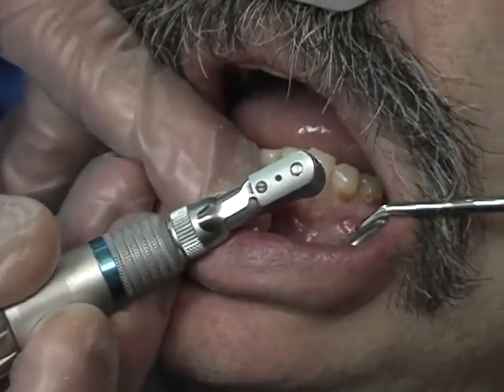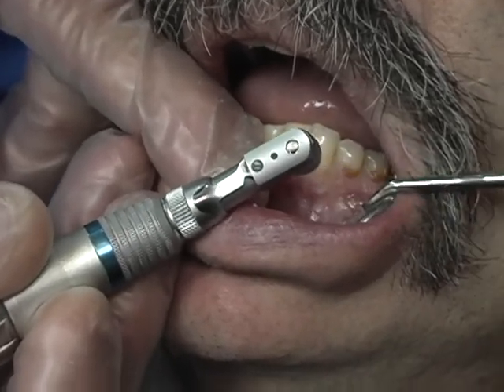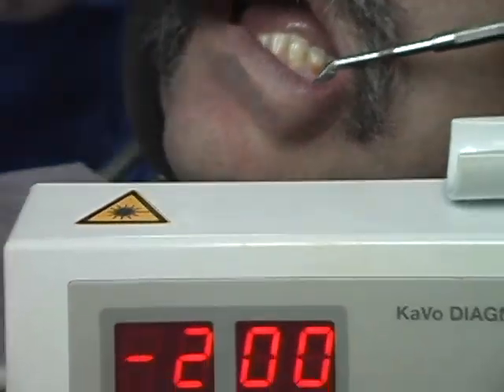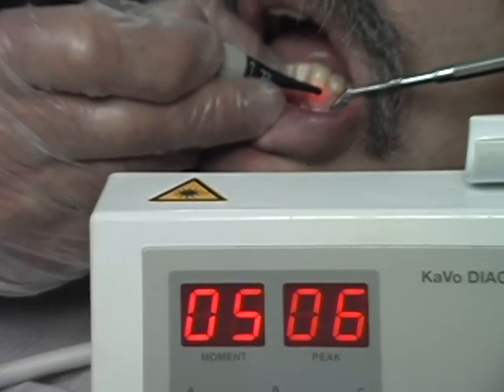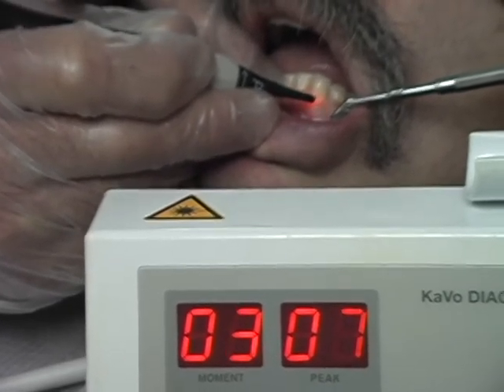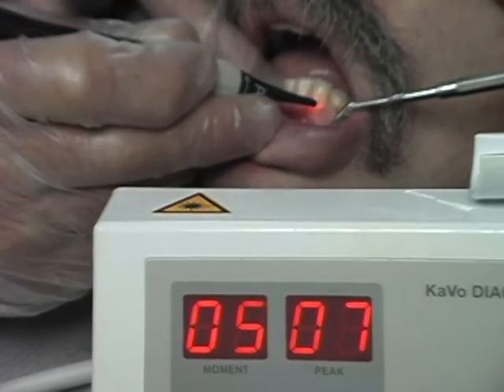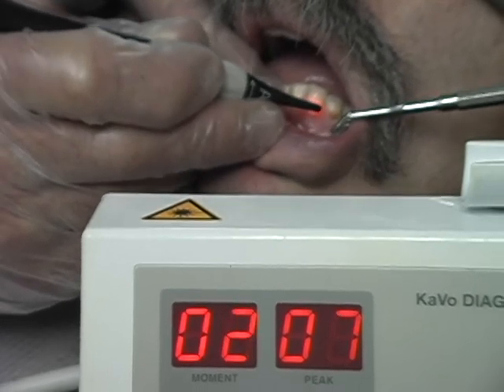We're just a few moments here, we'll have this cleaned again and we're going to use the Diagnodent again to see if we have any more decay. Much better — now as you see, we're getting a low reading like two to three. This will ensure that we get a superior bond to the composite resin that we're going to put in here.